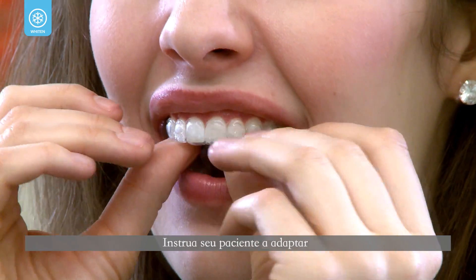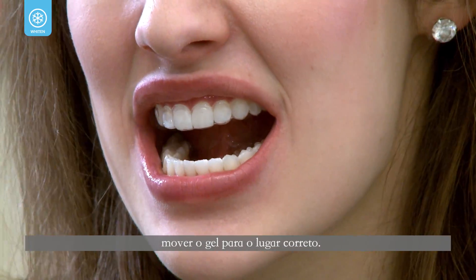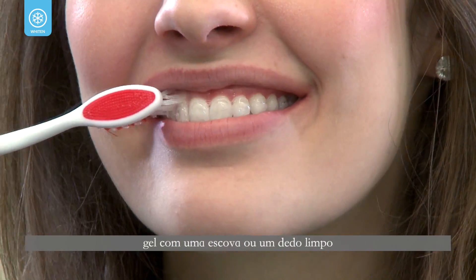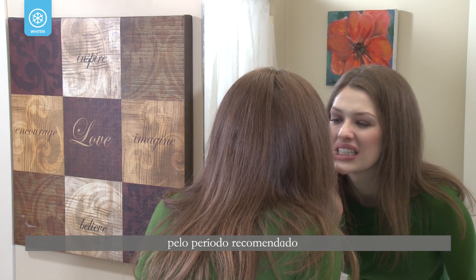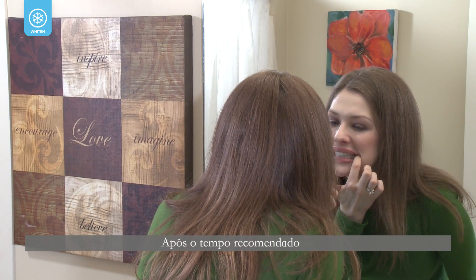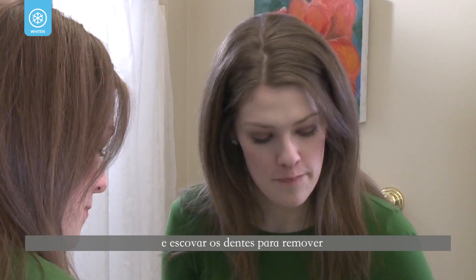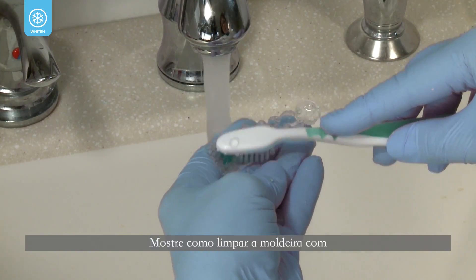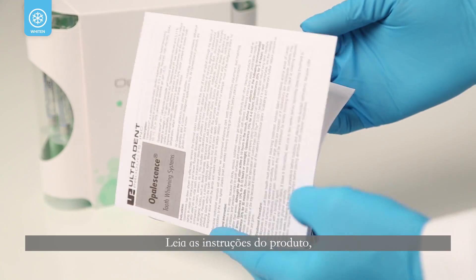This should use about one-half to one-third of a syringe. Instruct your patient to place the tray over the teeth and gently press the tray to move the gel into place. Ask them to gently wipe off excess gel with a toothbrush or a clean, moist finger. The patient should leave the tray in for the period of time recommended by their dentist. After the recommended time, have them remove the tray and brush their teeth to remove all gel. Show them how to clean the tray with a soft brush and cool tap water.